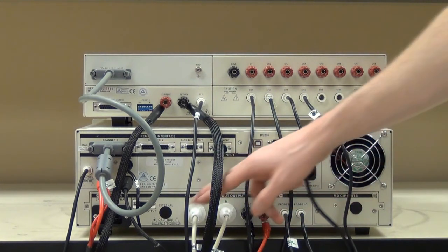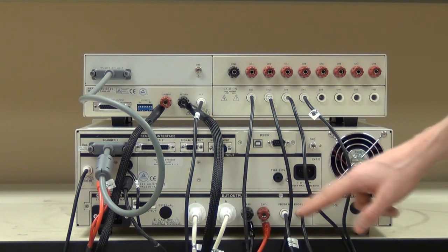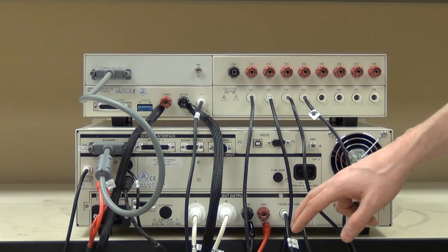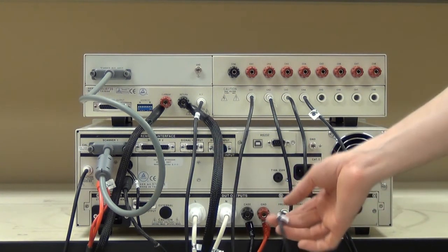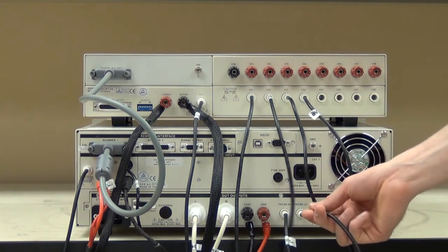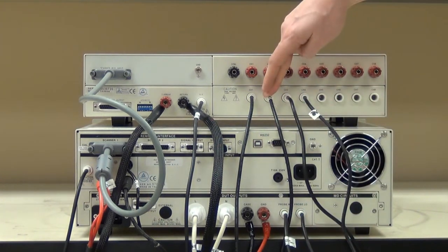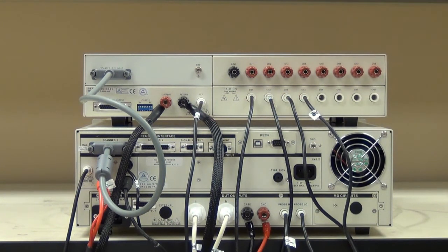Additionally, as you can see, we have our adapter box and case connections. And finally, we have our probe high and probe low. Since we're doing patient leakage testing, these are important. I have probe high connected from the probe high terminal on the Omnia up to channel one on the scanner, and probe low from the probe low port on the Omnia to channel two on the scanner. In the next set of connections to the DUT, channel three will be connected to patient lead one, and channel four will be connected to patient lead two.